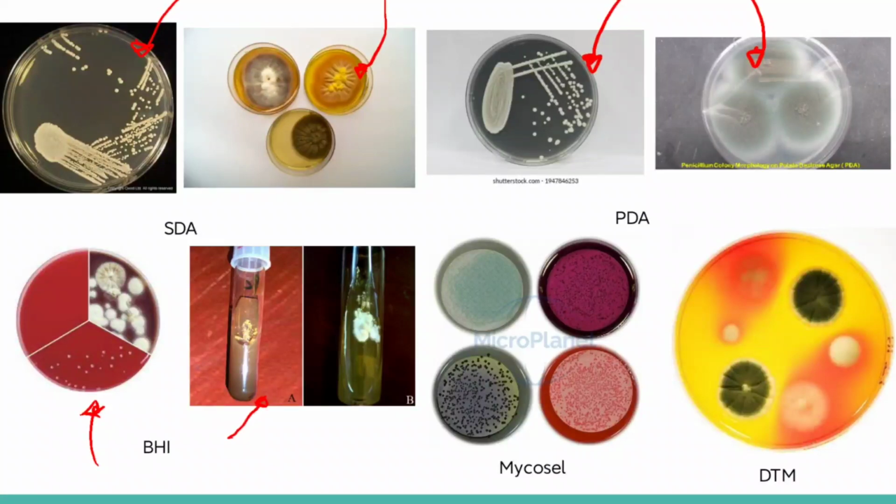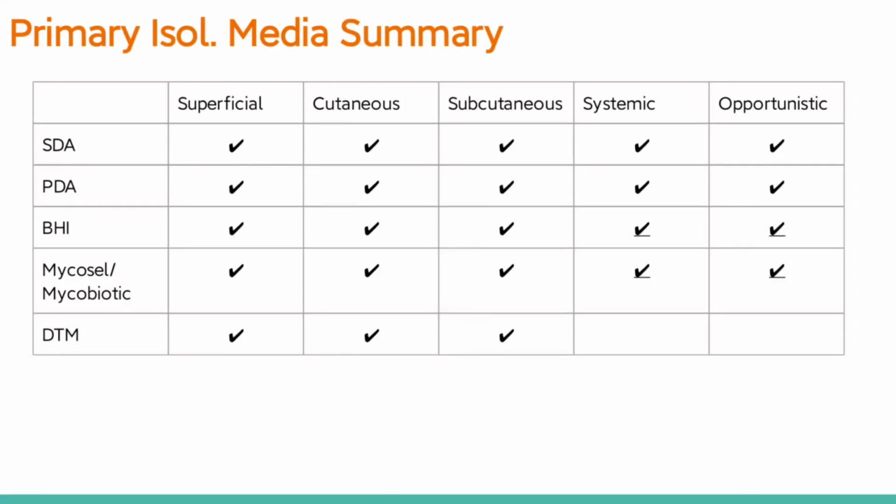No? Then this one, we have the mycocel. So mapapansin nyo, dito, ma-distinguish mo yung different dermatophytes. Yan. Then this one, we have the DTM as well, the dermatophyte test medium. So ayan yung ating summary of our primary isolation media. So most of them, lahat tumutubo talaga.